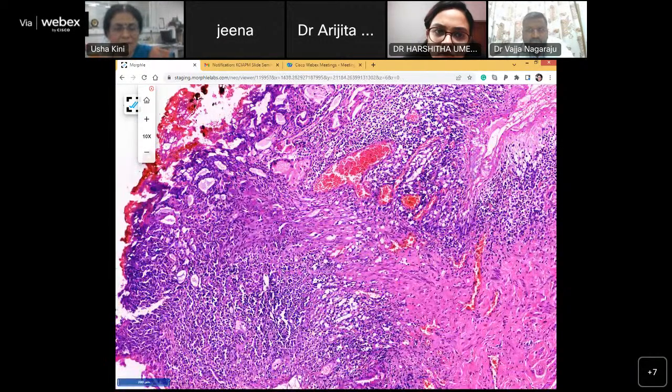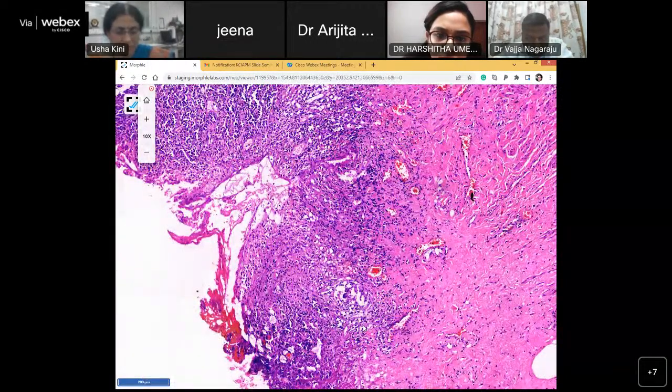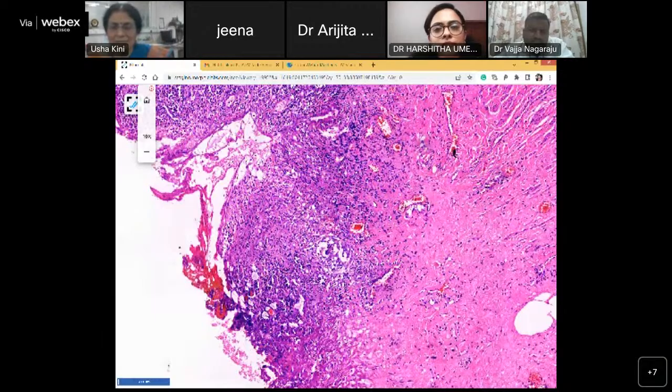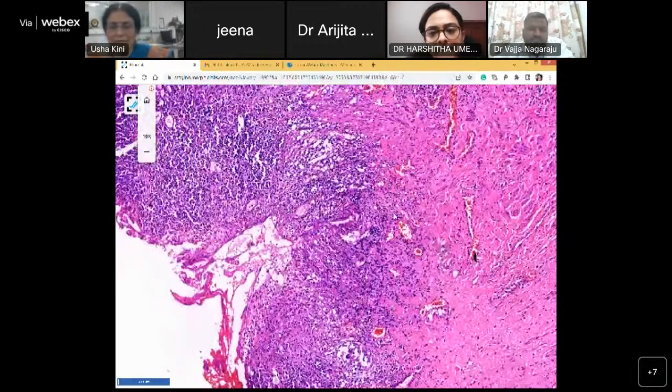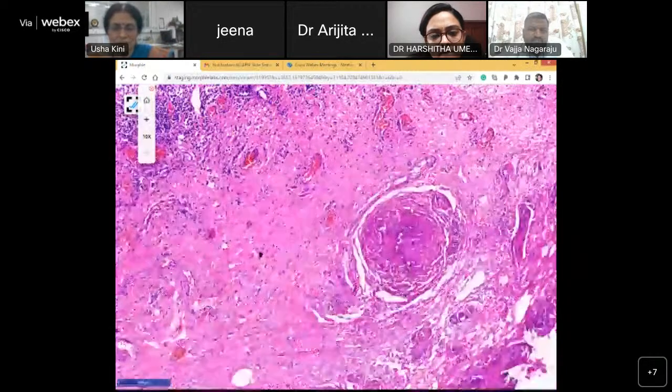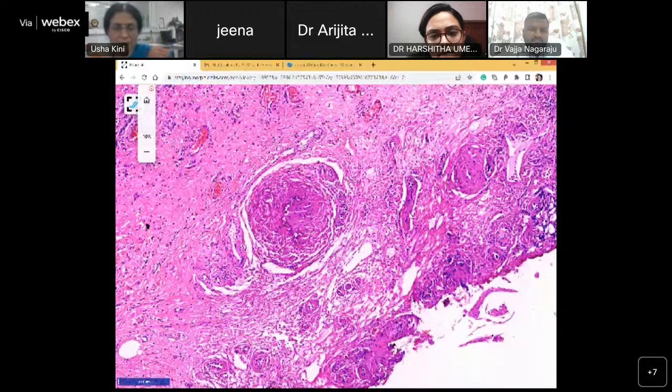See, this is an incipient granuloma. This is a multinucleate giant cell surrounded by these. You have a lot of inflammation around it, bound to be because it's ulcerated. But the other blood vessels are perfectly normal. These are the deeper vessels which are a little muscular. I wouldn't be worried.